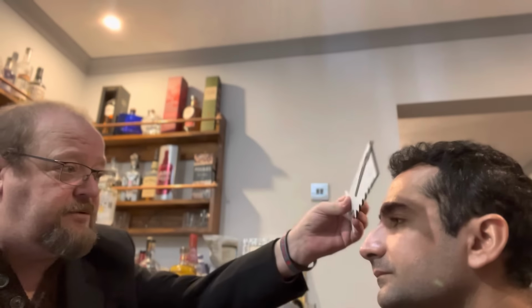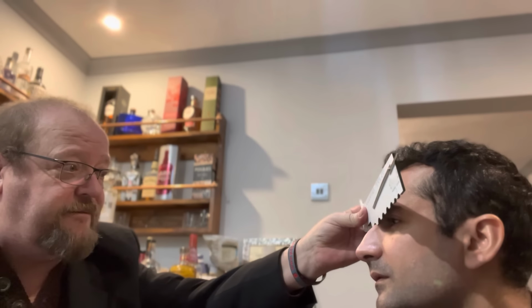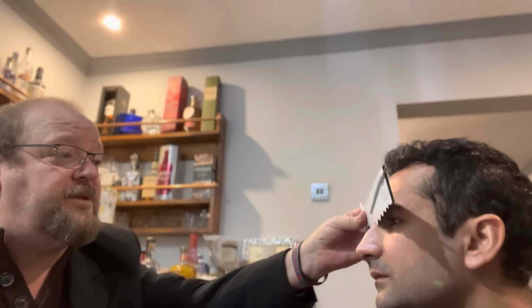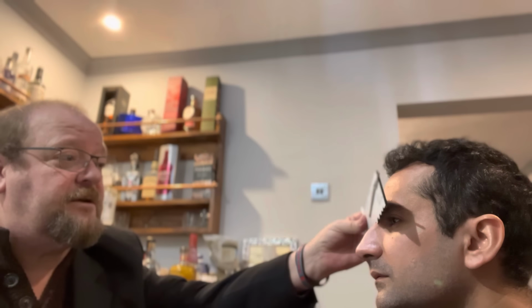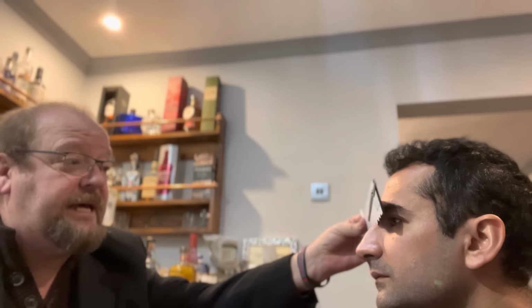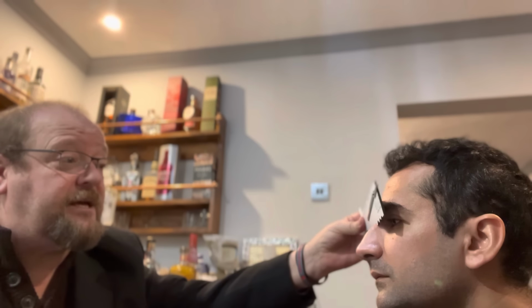So now I'm going to measure the crest of your bridge. For the crest, you'll see we've got all these grooves on the ruler, and we're going to start with the biggest and work down till we find the correct size. You'll notice straight away as I put this on, the 12 is massive. I'll move it to 10. There's still a lot of movement there. As I move it to 9, that's getting closer. There's still some movement, but it's very little. And actually I've still got a little bit of movement on the 8.